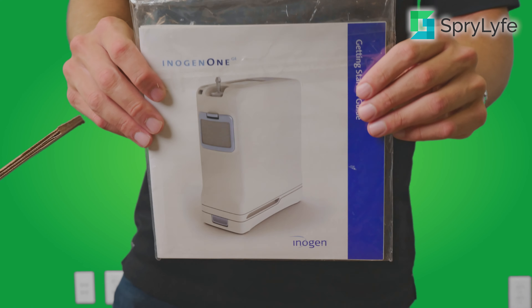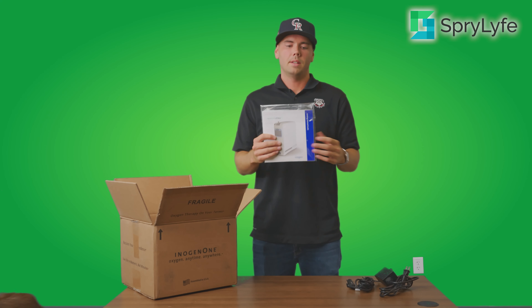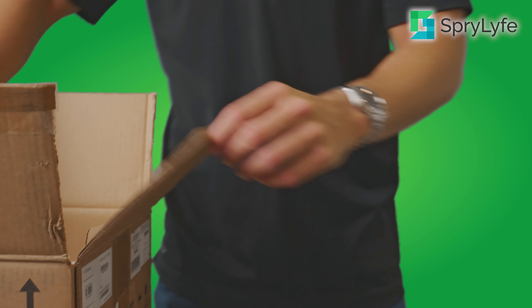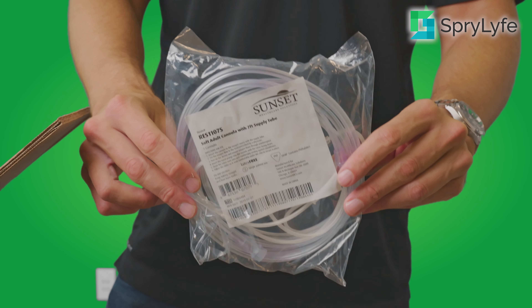We also get a user manual here for the Inogen 1 G4. This will cover everything from the unit, flow settings, all of that good stuff, battery life, any troubleshooting issues you might have. You will also get a standard nasal cannula — a four-foot nasal cannula that comes included with your Inogen 1 G4.